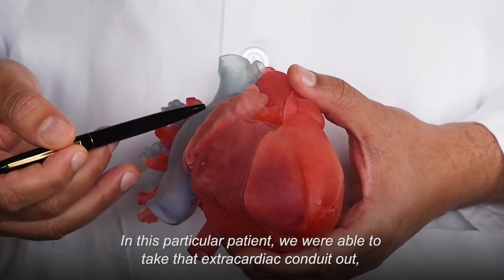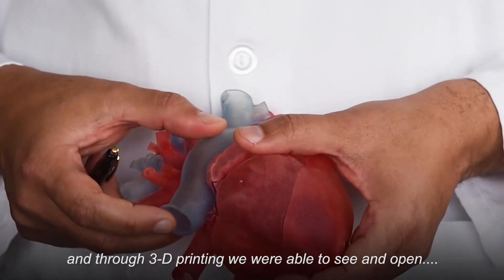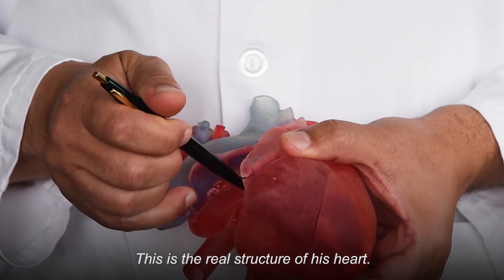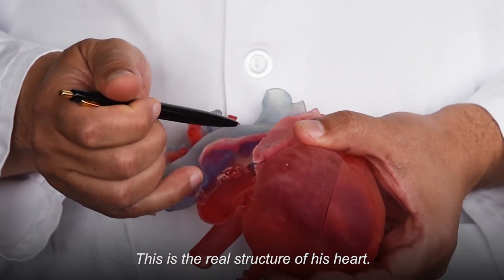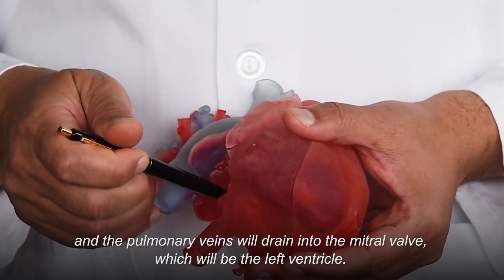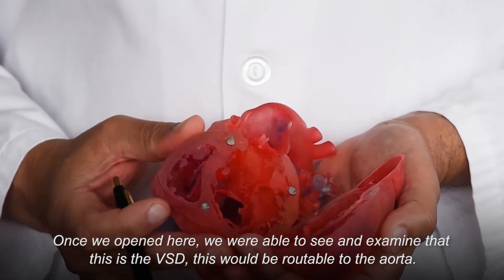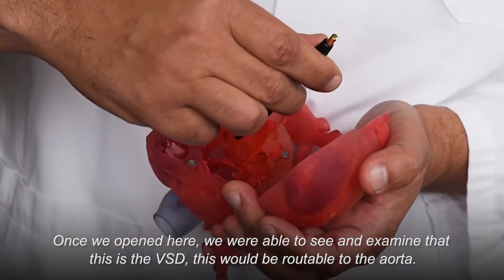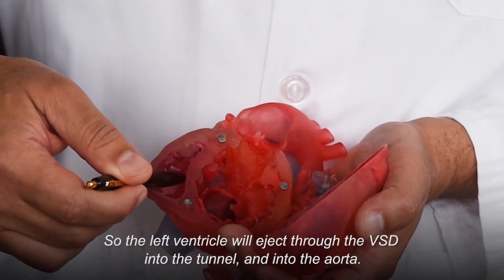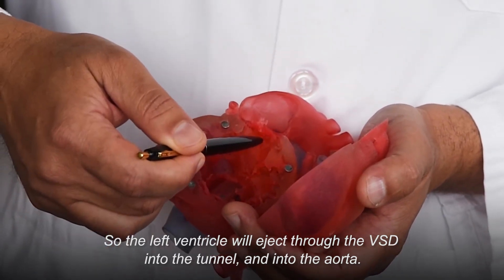In this particular patient, we were able to take that extracardiac conduit out, and through the 3D printing we were able to see and open this — this is a real structure of his heart. We can route the inferior vena cava into the tricuspid valve, and the pulmonary veins will drain into the mitral valve, which will be the left ventricle. Once we opened here, we were able to see and examine that this is the VSD, which would be routable to the aorta, so the left ventricle will eject through the VSD into the channel into the aorta.